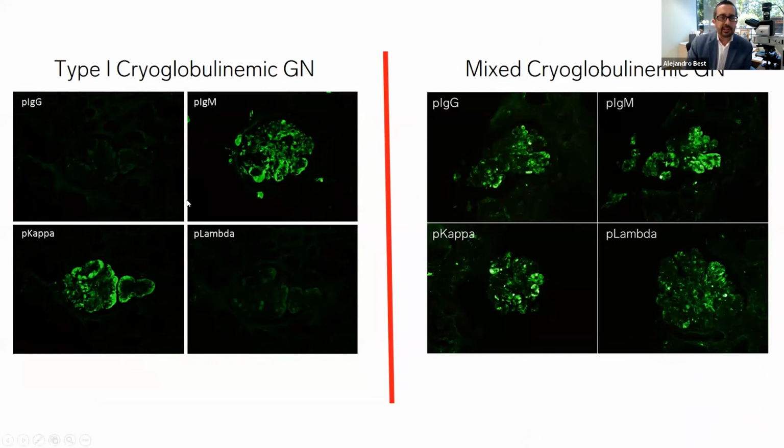In the first case that I showed, or the only case I showed, when you have clearly M kappa or a G kappa that the patient has, known circulating cryoglobulin or positive cryocrit, then it is a type 1 cryo, right? No, you can't argue with that.